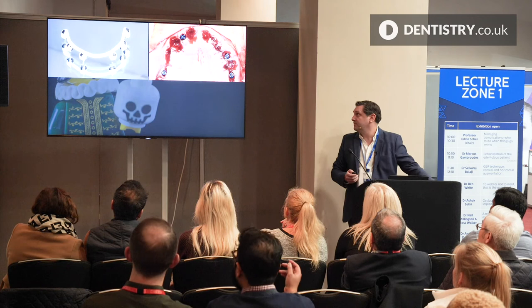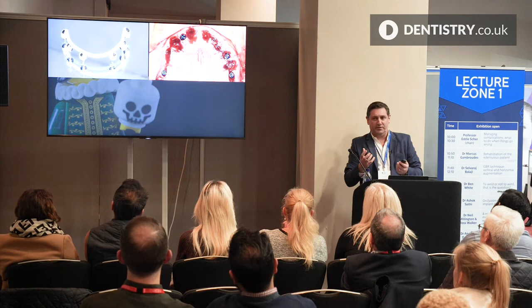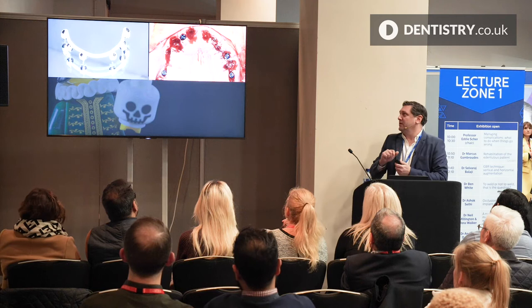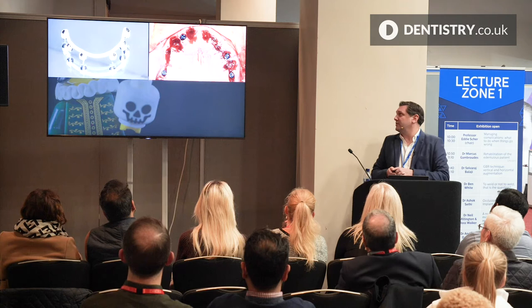And then when we've got Axiom, we have what's called a lab lock. These are little push buttons or push threads that are designed for the technician in the lab, so they can take the restoration very easily on and off the model without having to screw it into place. The advantage here is we can take our framework, click it up into place, and then put our cure resin around and remove it without having any screws that impact on our occlusion, so the patient can bite directly onto the temporary so it knows it's seated correctly.